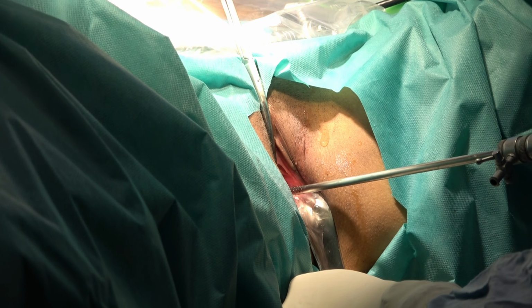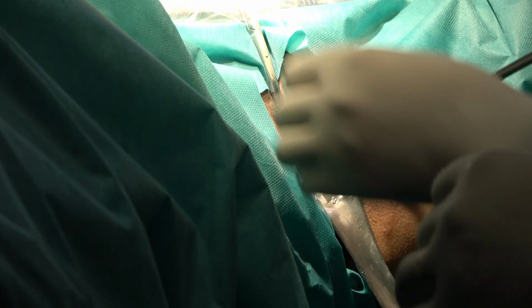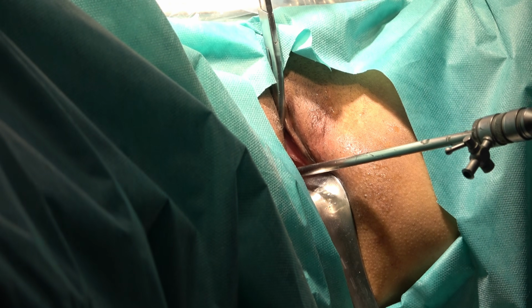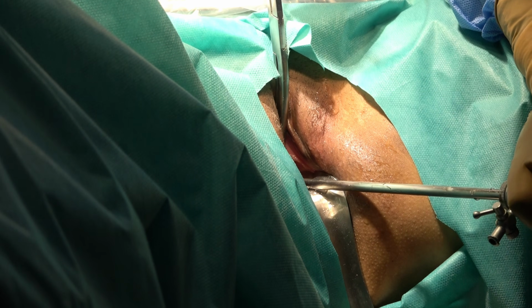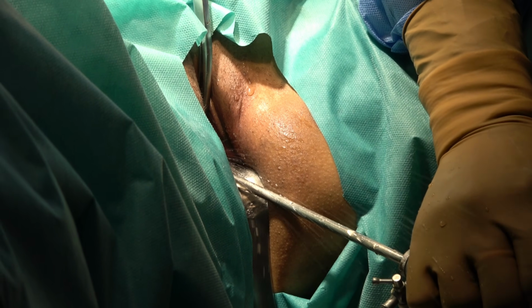Before the resectoscope, you should also introduce a diagnostic hysteroscope. So make sure that you can see all the structures and that it is clear. And after that, you should introduce the resectoscope. So this is the 4-channel diagnostic hysteroscope that we are introducing, and here it is slowly introduced. After that, we will do the diagnostic, and then we will slowly introduce the resectoscope.